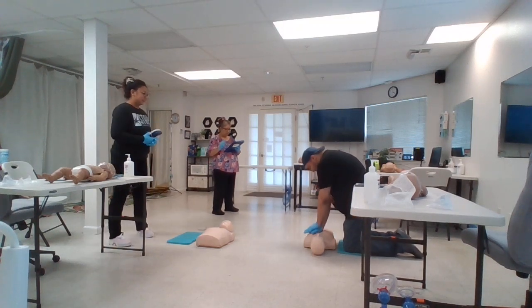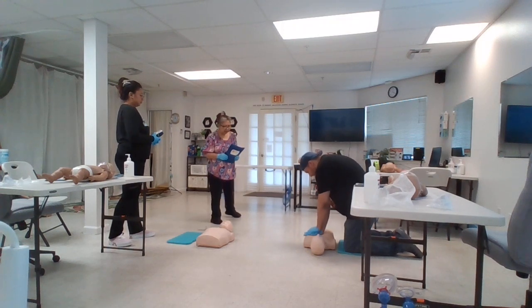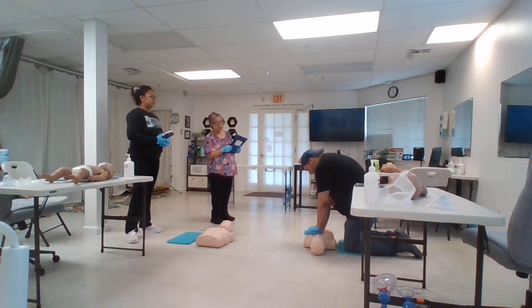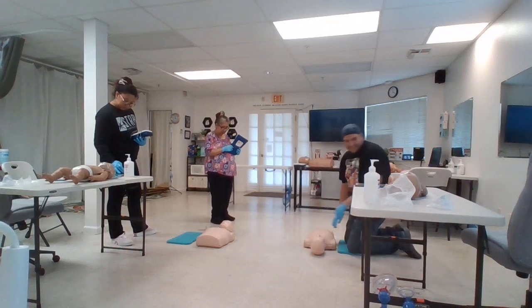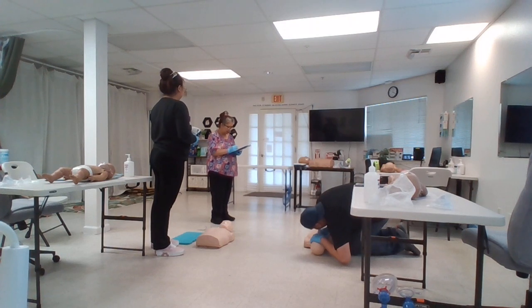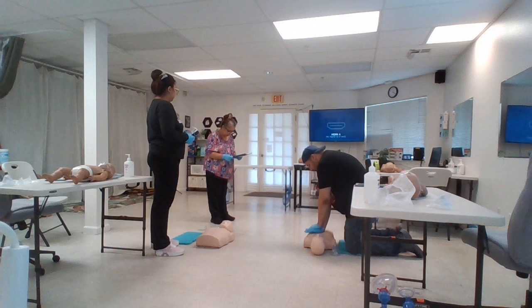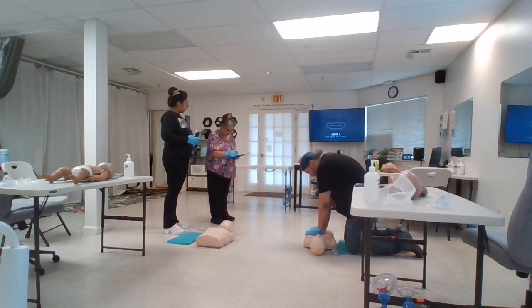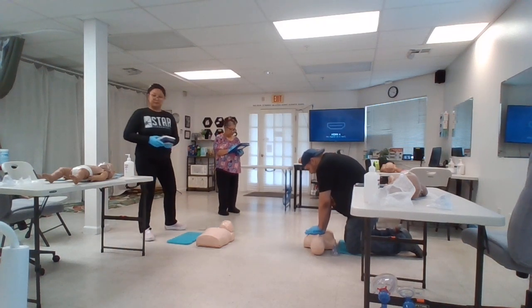Compressions: 1, 2, 3, ... 30. Okay. Again: 1, 2, 3, ... 24, 25.